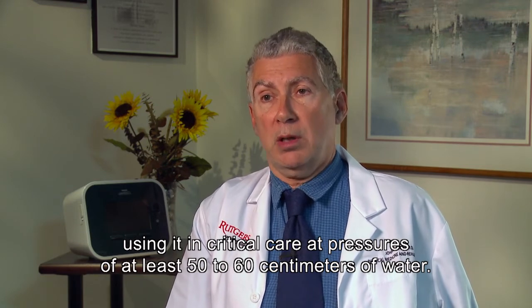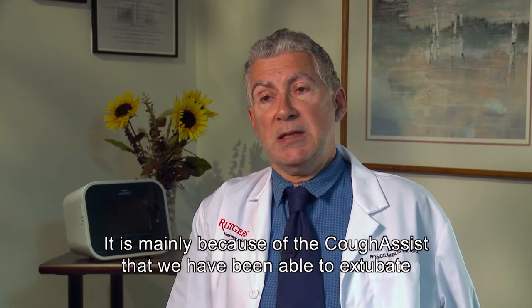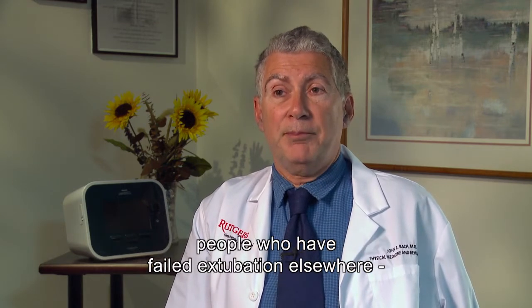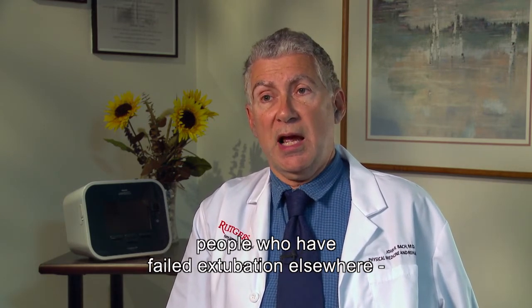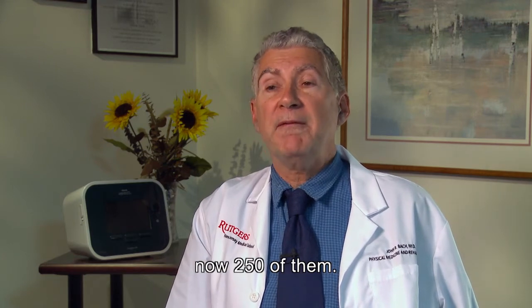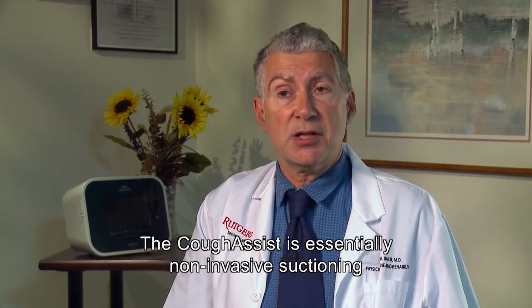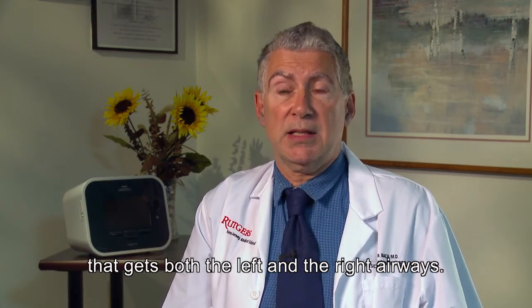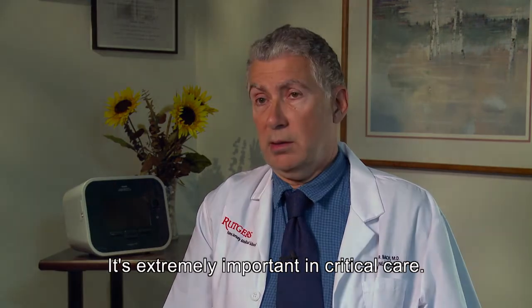It is mainly because of the CoughAssist that we have been able to extubate people who have failed extubation elsewhere, now 250 of them. The CoughAssist is essentially non-invasive suctioning that gets both the left and the right airways. It's extremely important in critical care.